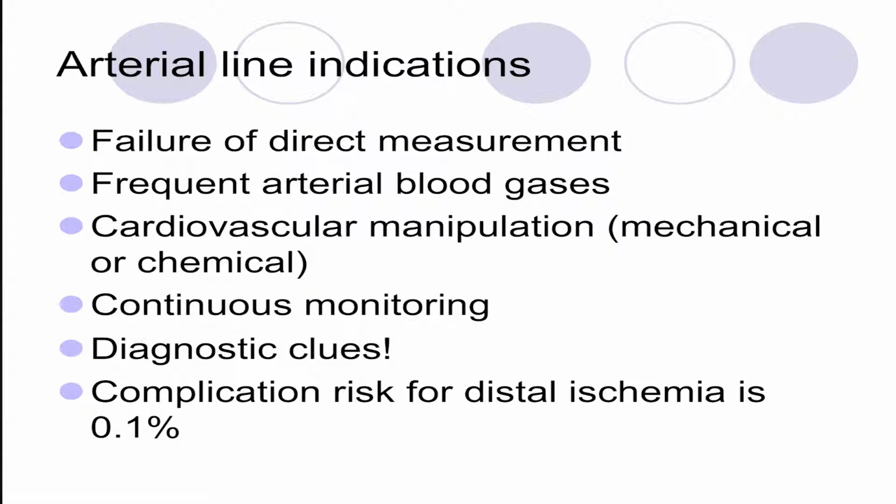If we're doing frequent gases, so if we're repeatedly getting into this artery, there's always a risk of infection with every stick that we do, and a lot of pain for a patient. So sometimes it's better to be stuck once if you're going to do frequent gases and have something to draw out of. Cardiovascular manipulation, balloon pumps, vasopressors, anything that we're doing to change their cardiovascular status, it just provides continuous monitoring, but it also, like CVP, gives us a lot of diagnostic clues.